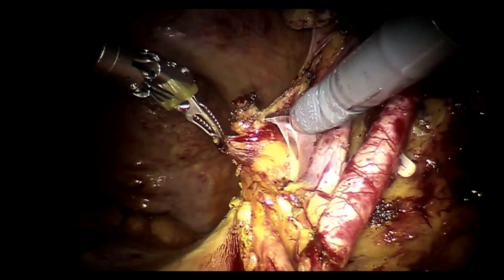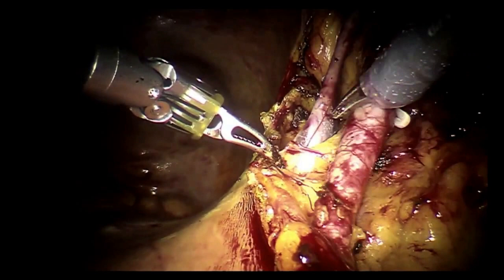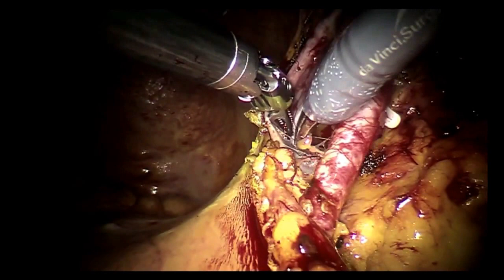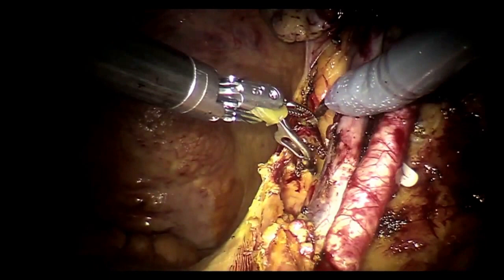We should raise a little bit of a flap if we can. So you're going to retroperitonealize. Raise a little bit of a flap if it works, but typically we can just hold it with stitches. All we have to do is just pex it laterally, to minimize or eliminate chances of rotation, but also for subsequent biopsies and such.